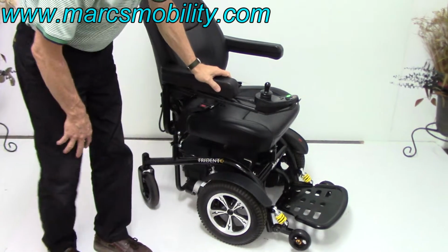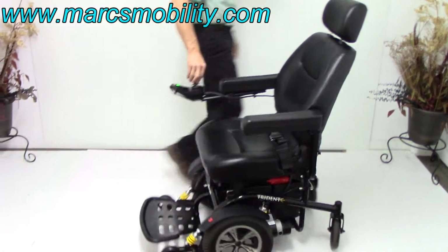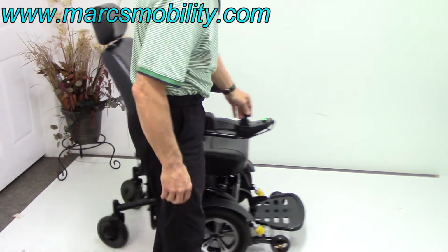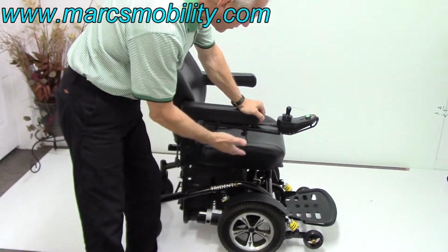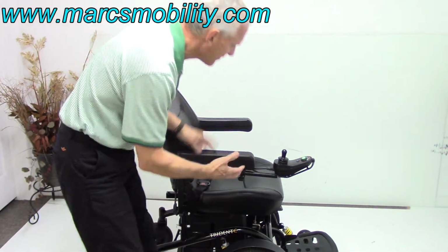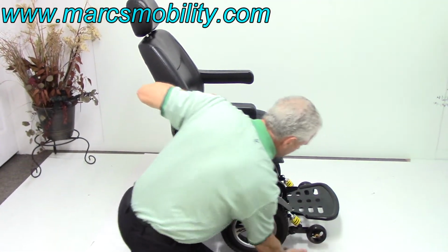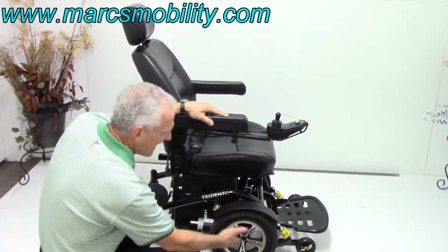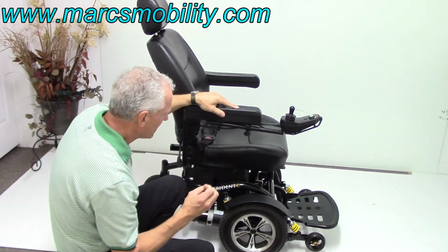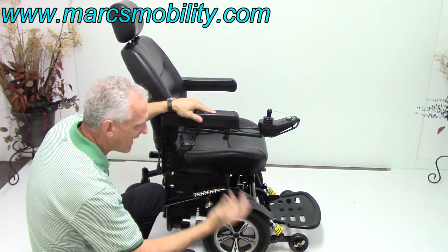I'm not sure if it's quite a mid-wheel drive, but it will have a good turning radius. This is going to be more of a front-wheel drive power chair. Now the benefit of this chair is, if you go outside, the chair weighs 200 pounds, you weigh 200 pounds, let's just say, that's 400 pounds. All the weight is going to be transferred from the power chair to the bottom of this wheel right here, because there's nothing in front holding the wheel back. So if you're going on grass, you will have better traction because all your weight is on the drive wheels, which is what you need if you're going to be in the dirt. Now, I mean soft dirt, grass, and sidewalk.